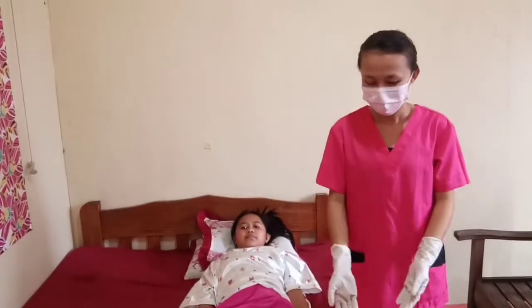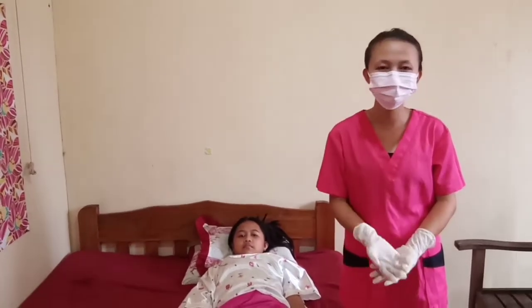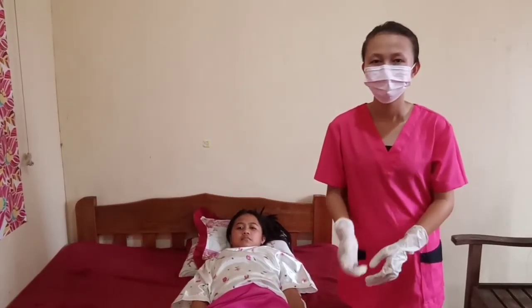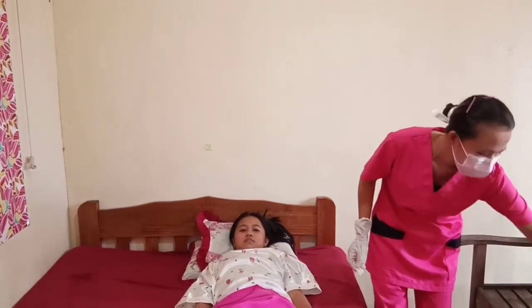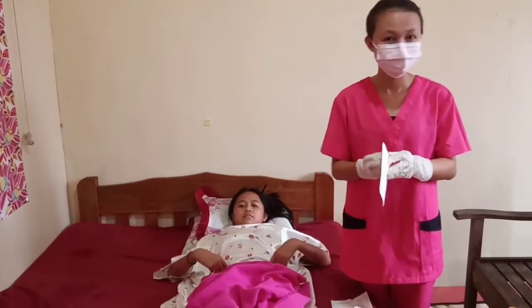And now, after the procedure, we're going to apply loose woven gauze as contact and cut 4x4 gauze flat to fit in around the drain. And then, pre-cut gauze is also available. So, the gauze here is already 4x4, so I don't need to cut it anymore.